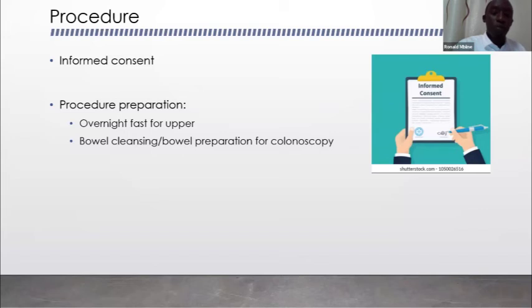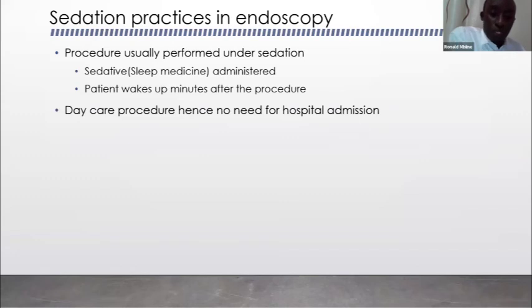For the colonoscopy, we do what's called bowel preparation or bowel cleansing. So we give medicine that gives fairly severe diarrhea just over a span of 6 to 8 hours. And then I hope you remember seeing how clean the colon looked. So the medicine actually washes all the stool out, and the procedure is done. If the bowel preparation is not done, it's not a very good experience, both for the patient and for the surgeon providing it.